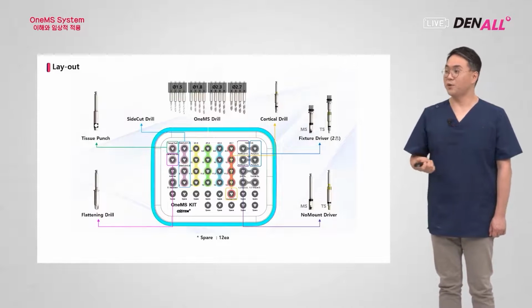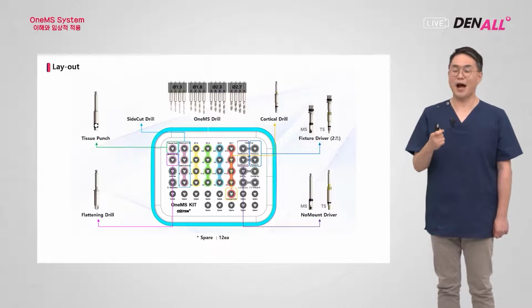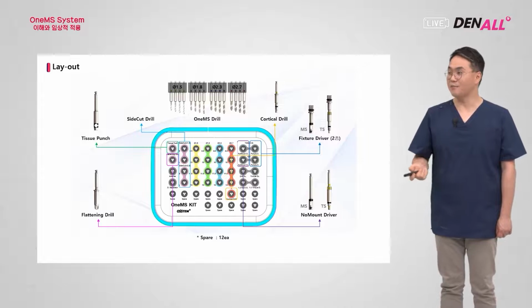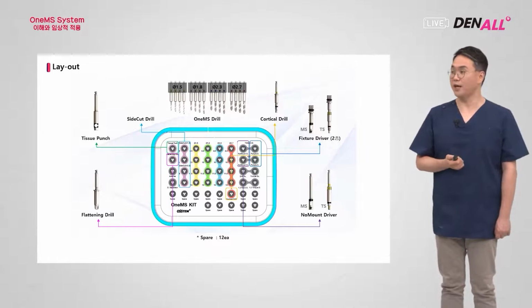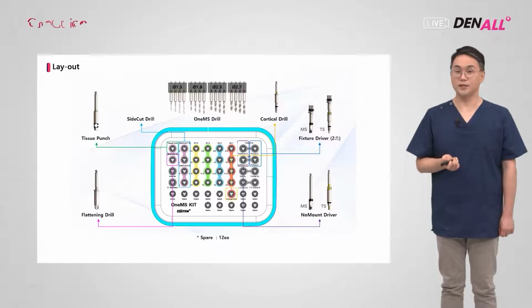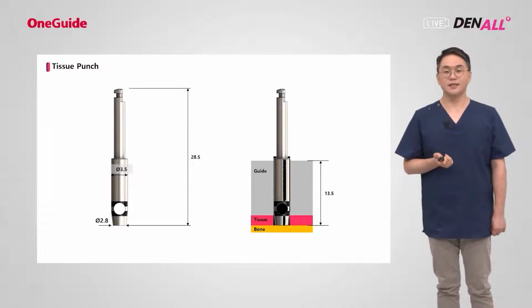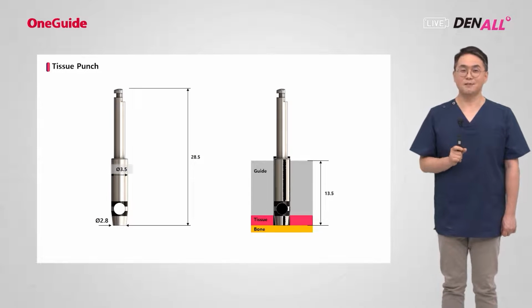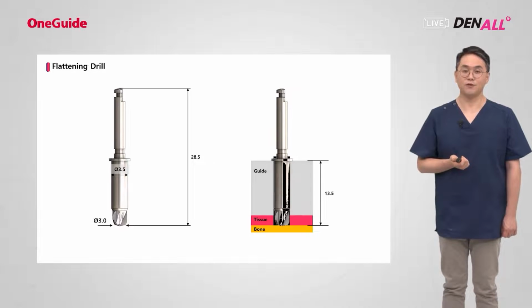So this is how the kit looks, and everything is very narrow in diameter. The flattening drill and the others are the same as in the OneGuide kit, and implant drivers and drills are included. Now, in the case of the tissue punch, on the lower anterior side the gingiva is thin, so you don't often use it. But if you need it, then you can use this tissue punch.